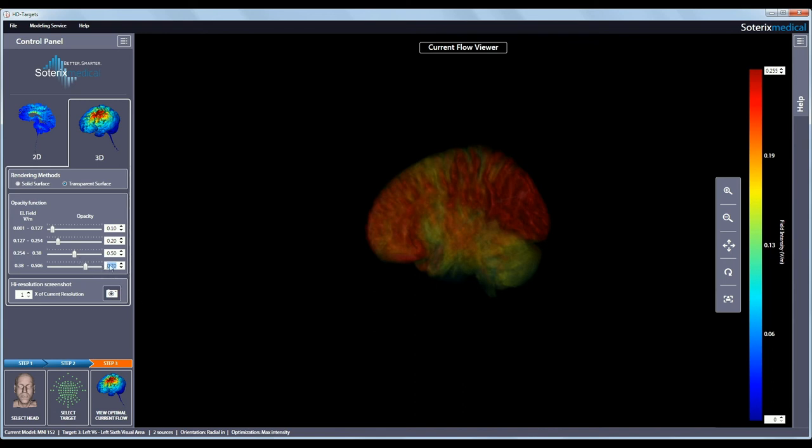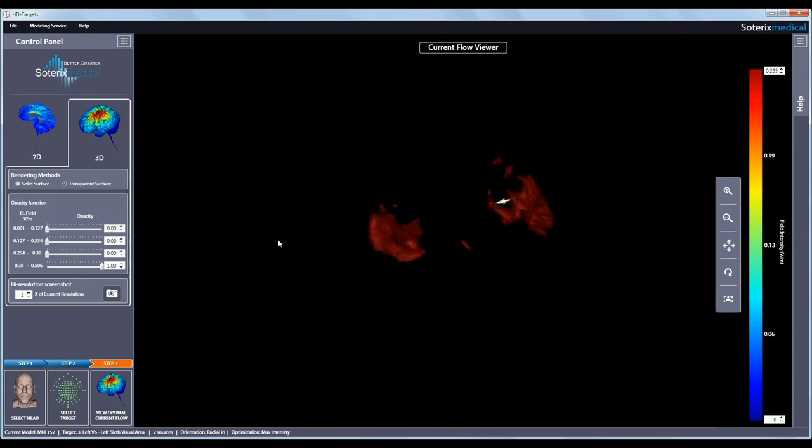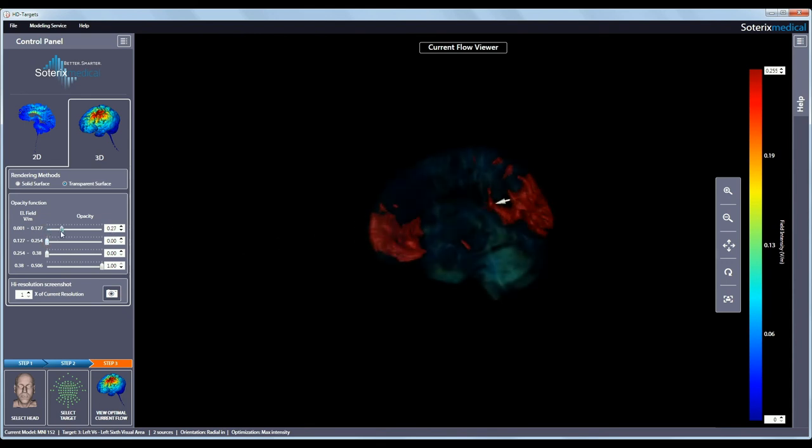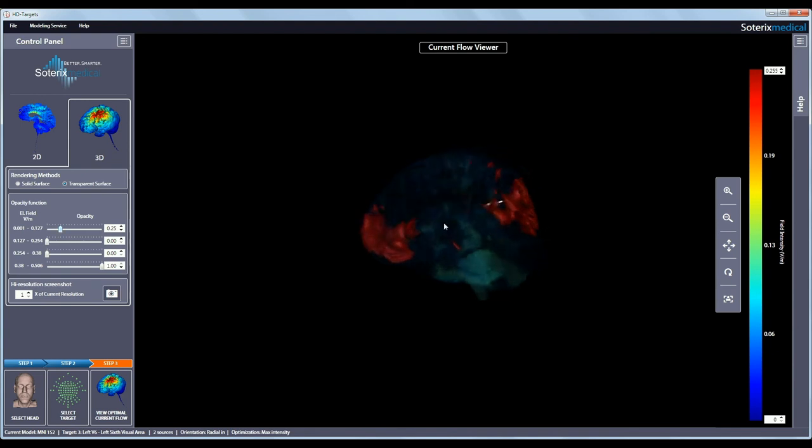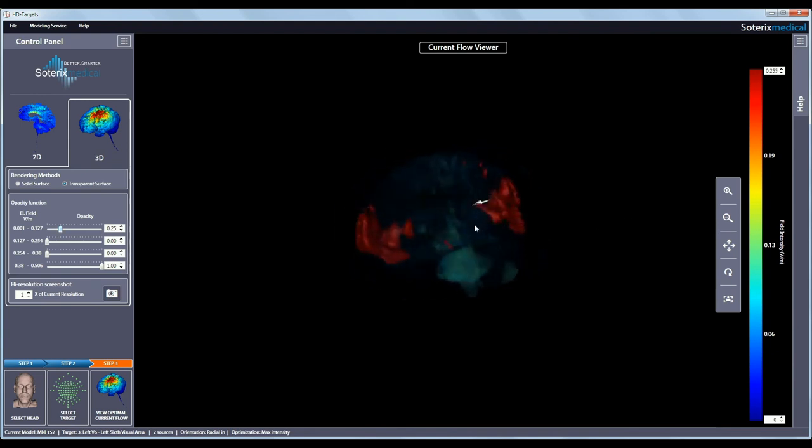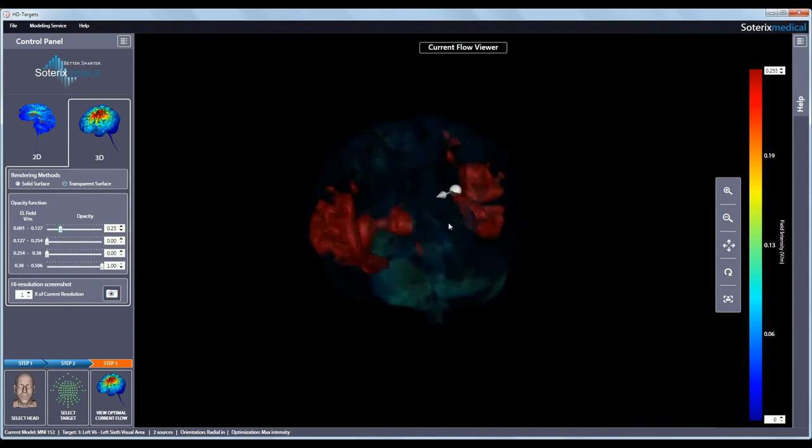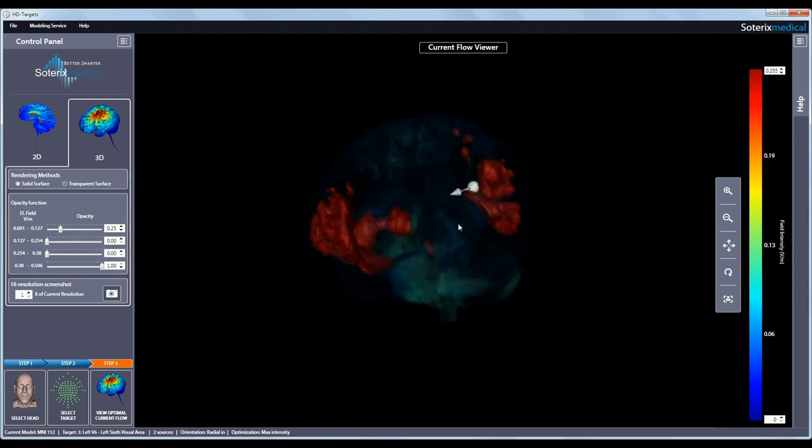For example, for viewing the volume of the brain where the top 25% of maximum electric field is induced, you would set the opacity to 1 in the last range while setting the opacity to 0 in the other 3 ranges. You can then make the lowest 25% semi-transparent to better appreciate the extent of the max 25% electric field distribution. The target and the desired orientation is shown at all times.